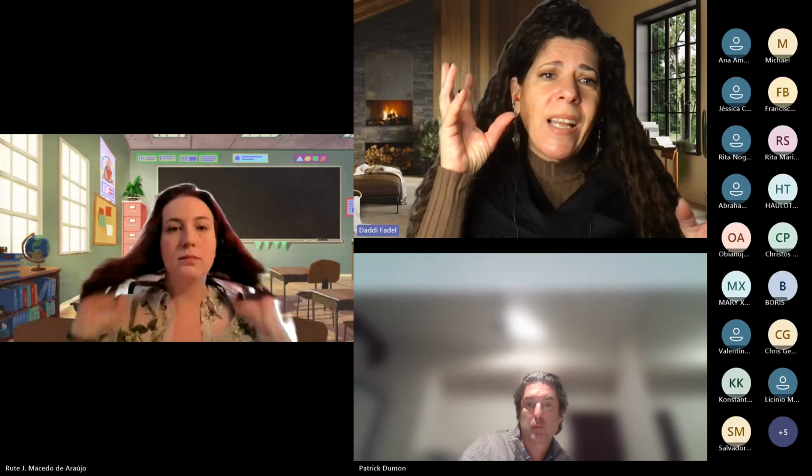But I started fitting scleral lenses when technology was not available, for about 10 or probably 15 years. I fit the scleral lenses without any technology. I didn't even have a digital camera on my slit lamp. Some of the pictures you have seen in this presentation and in my publication, my book, were taken with an iPhone 6 on the slit lamp. So what you need is only a stable hand, and that's it. You need a slit lamp, an iPhone 6, fluorescein, and scleral lenses. That's all to start fitting scleral lenses.